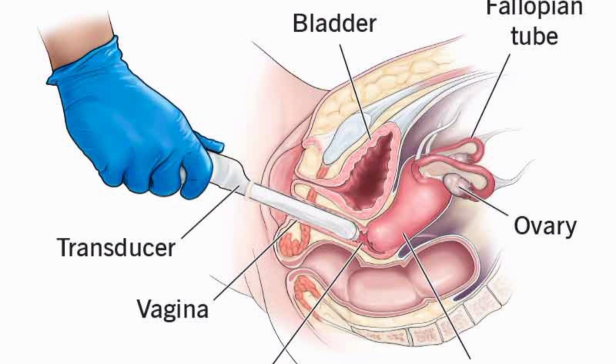For transvaginal sonography, regarding patient preparation and position, the patient's bladder should be empty, as opposed to the transabdominal technique. The empty bladder will allow close proximity of the transvaginal transducer to the body of the anteverted uterus. With bladder distension, the anteverted uterus is displaced cranially outside the effective view range.